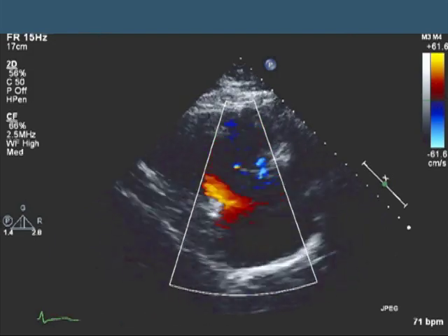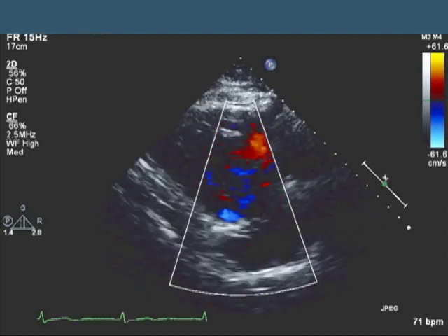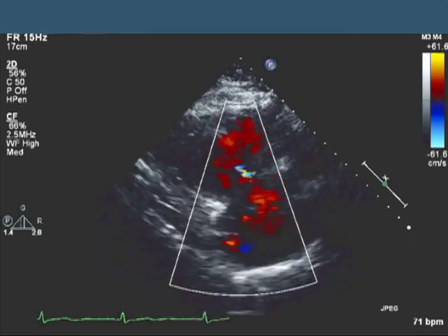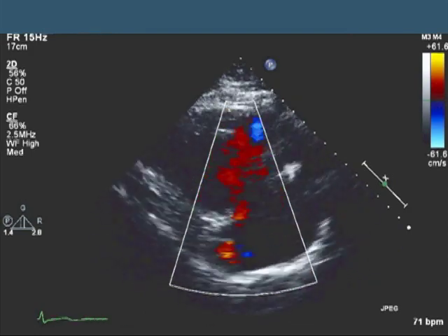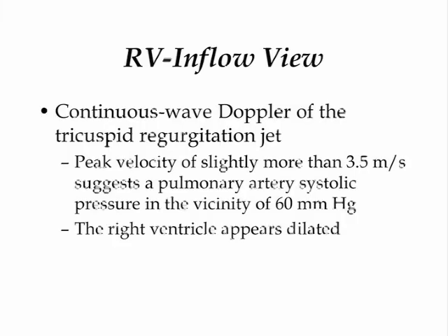Here in the first image, this is an RV inflow view with color Doppler. You can see that there is a moderate tricuspid regurgitation jet. The TR velocity is a little more than 3.5 meters per second. That usually translates to a pulmonary artery systolic pressure of about 60 millimeters of mercury, assuming the mean RA pressure is about 10 millimeters of mercury. Nothing particularly exotic here. You'll notice upon inspection that the RV looked somewhat dilated, but there's nothing particularly unusual about a TR jet with a velocity of 3.5 meters per second.